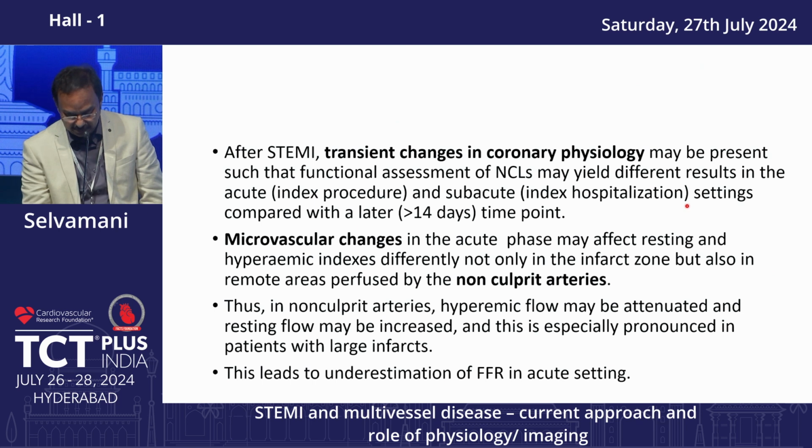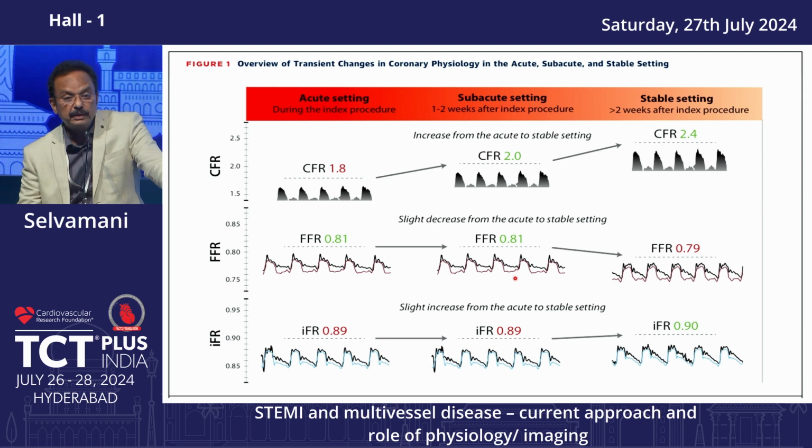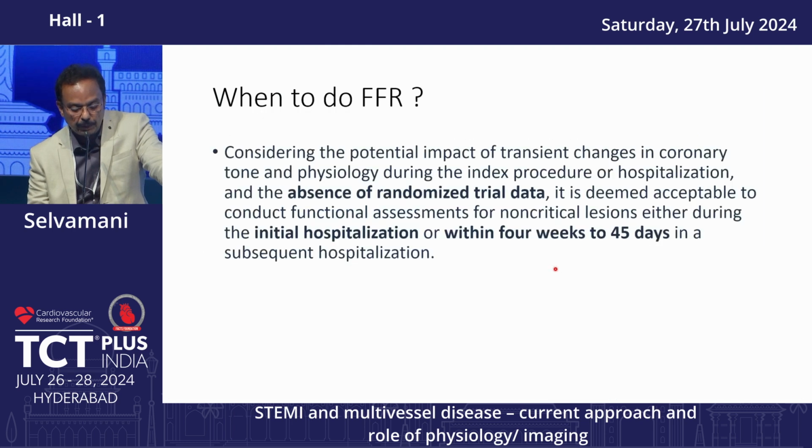But whenever you are doing physiology, just remember one thing. If you are doing it in the same index procedure, that is within 1 week or so, when you measure an FFR, probably your FFR might be falsely high. That is, you might underestimate the lesion. And if you are using resting indices, probably you might be slightly overestimating the lesion. So just remember this point, and then proceed.